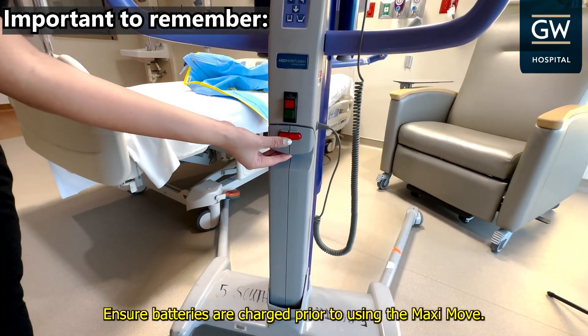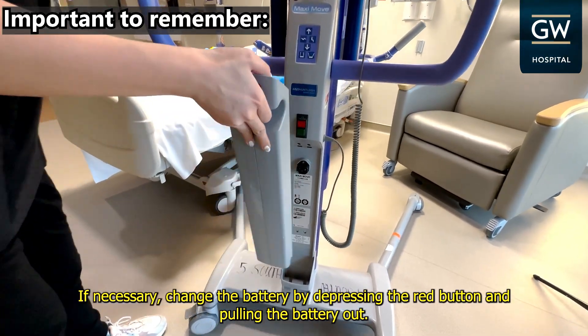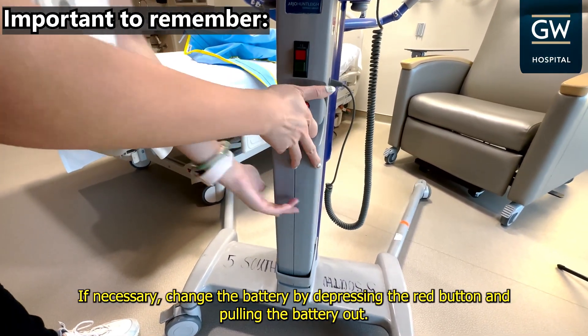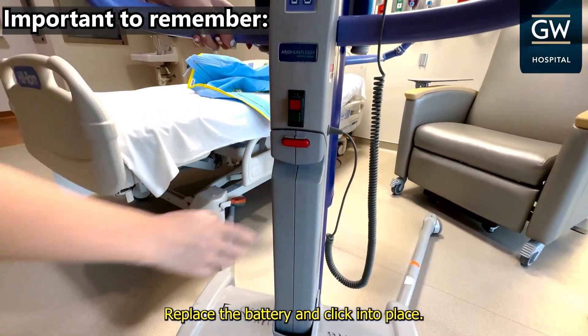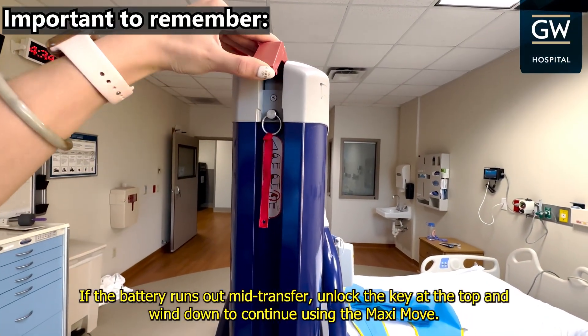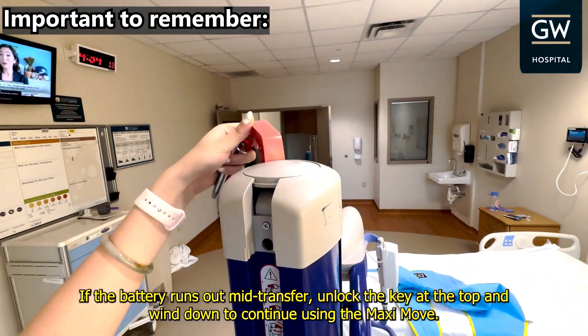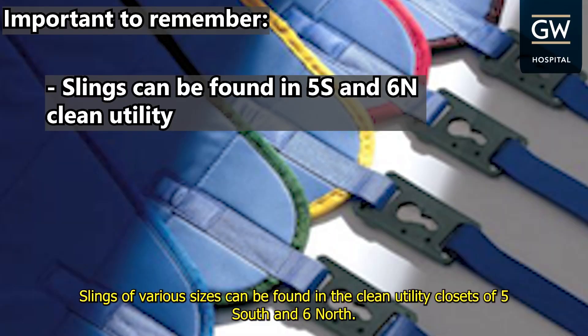Ensure batteries are charged prior to using the MaxiMove. If necessary, change the battery by depressing the red button and pulling the battery out. Replace the battery and click into place. If the battery runs out mid-transfer, unlock the key at the top and wind down to continue using the MaxiMove. Slings of various sizes can be found in the clean utility closets of 5 South and 6 North.